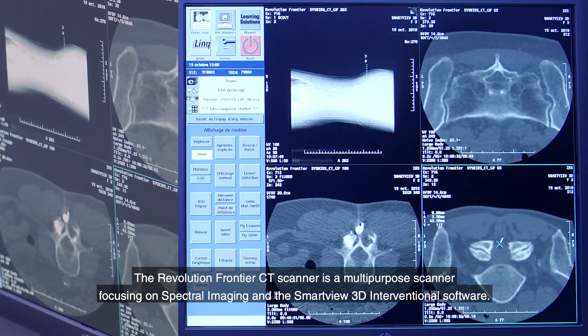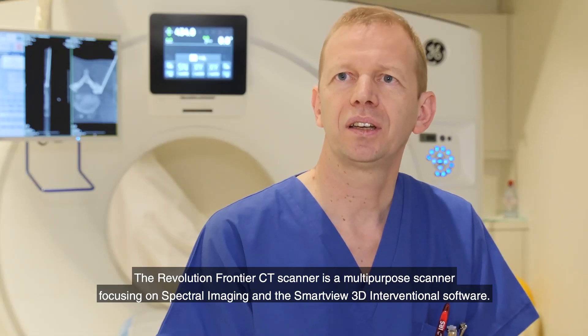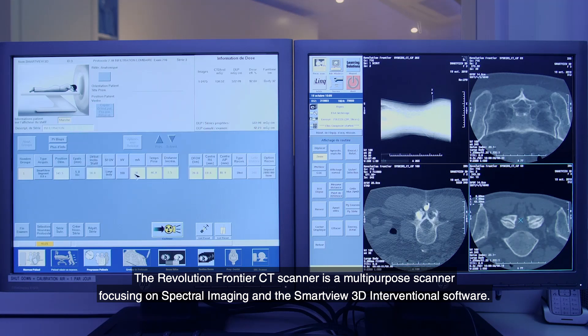The Revolution Frontier CT scanner is a multi-purpose scanner focusing on spectral imaging and the SmartView 3D interventional software.